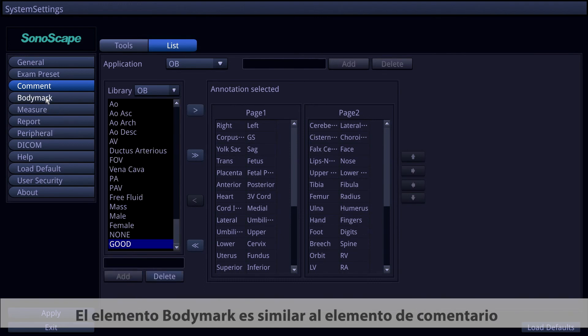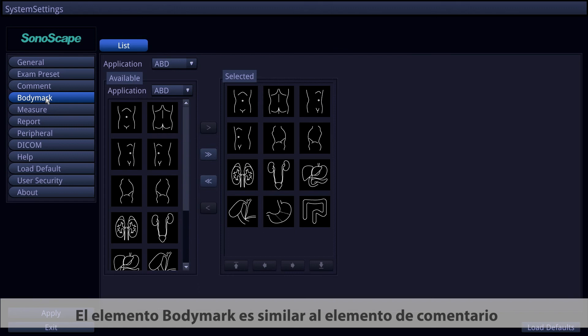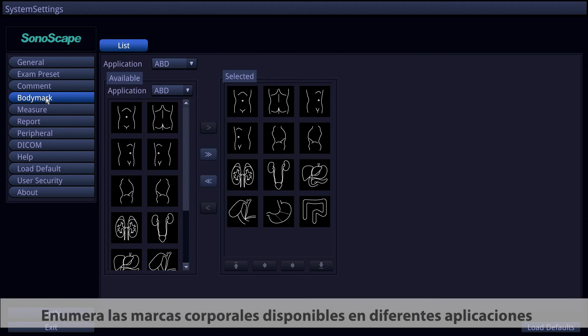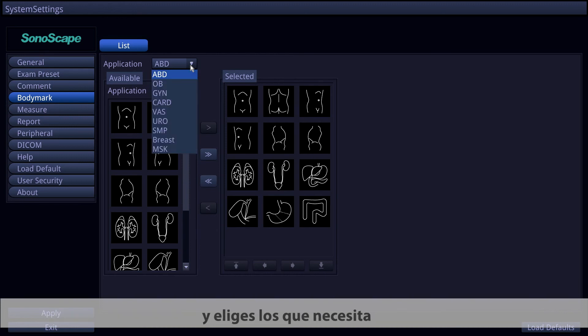The Body Mark item is similar to the Common Item — it lists available body marks in different applications and allows you to select the ones you need.